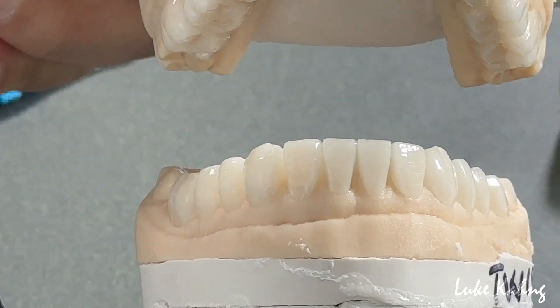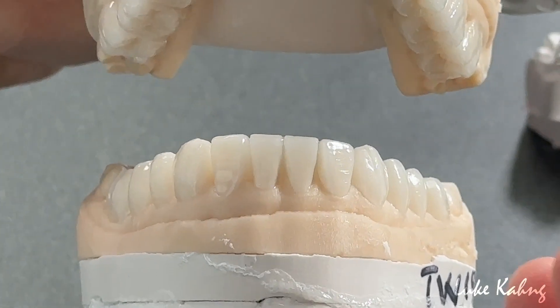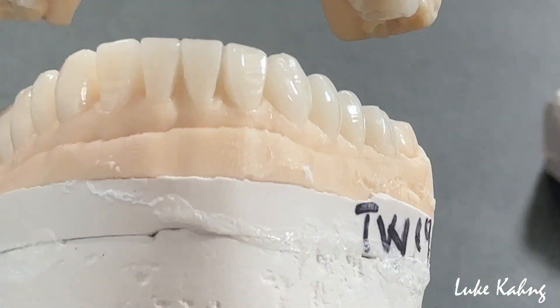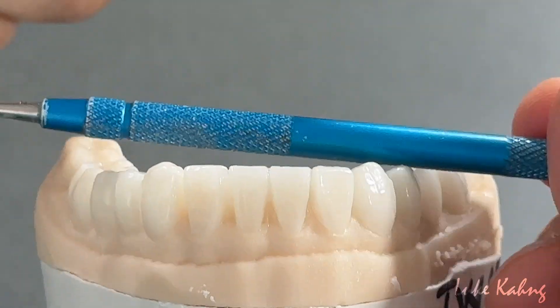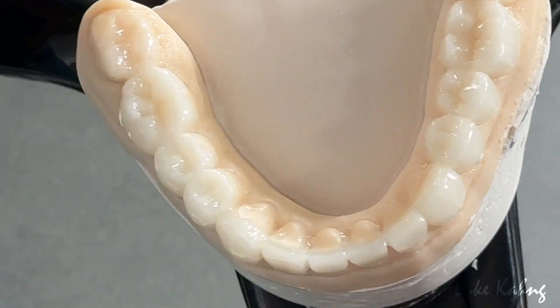Not making it too wide — trying to bring it down as much as possible — so I make a good height in three dimensions. It's the buccal corridor, like I said. Here is the curve of Spee with the anatomy.